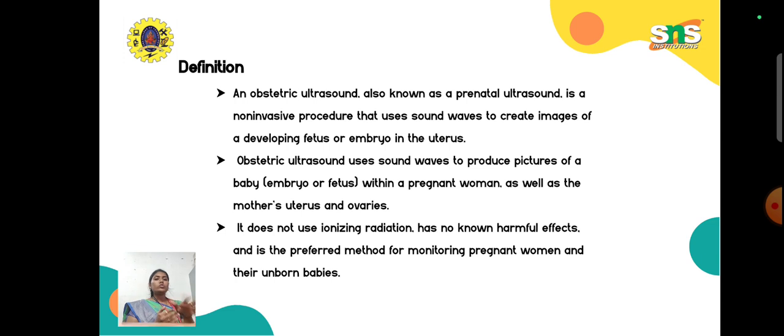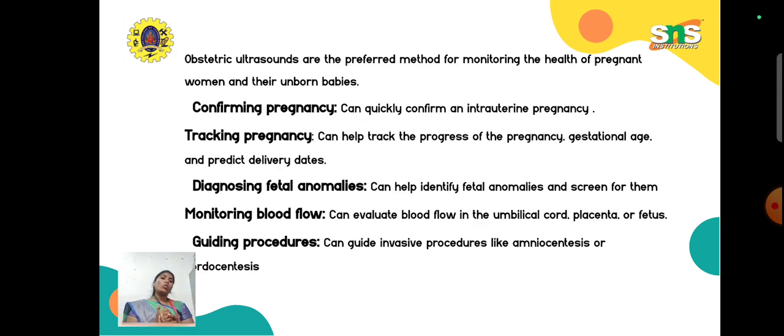Abstractly, ultrasound has the same principle. Since it is non-ionizing radiation, it is not harmful to that extent, so we highly recommend it in the obstetric field to monitor the pregnant woman and unborn baby. First, we can confirm the pregnancy, whether the embryo is located in the uterus or has been misplaced somewhere else, and we can track the pregnancy.